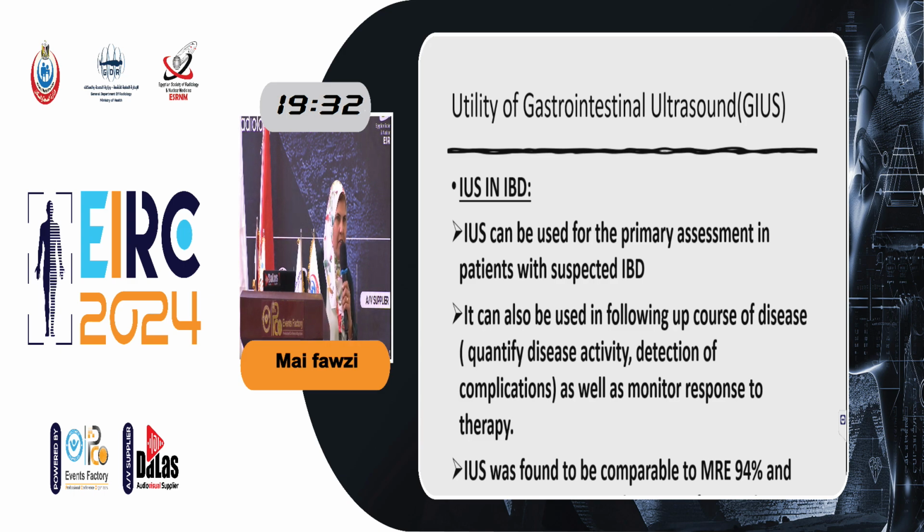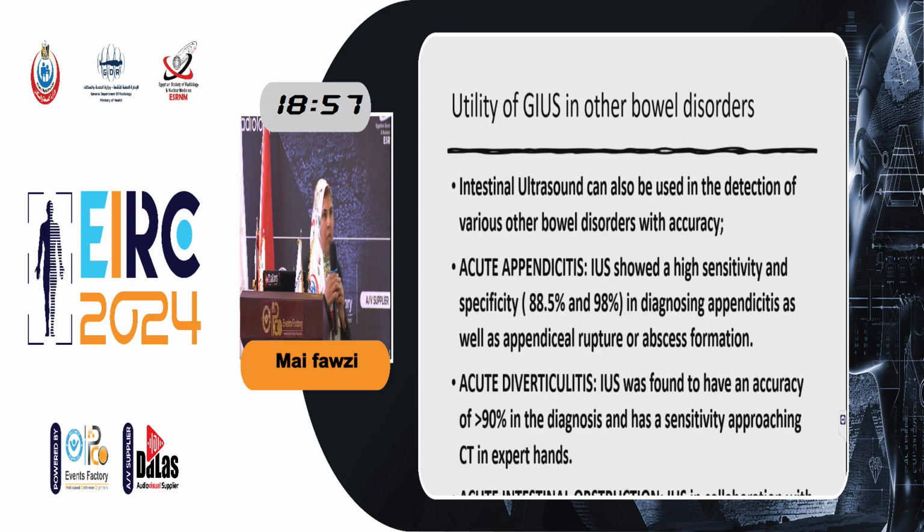What are the uses of intestinal ultrasound? The most important and very recently explored area is IBD, because patients with IBD have a very chronic, long-lasting disease, and they always need follow-up. So one of the important markers is ultrasound. The ECCO-ESGAR has recently introduced intestinal ultrasound as a cross-sectional imaging for patients with IBD on par with magnetic resonance imaging. Comparison between them has been almost equal, MRE and intestinal ultrasound.